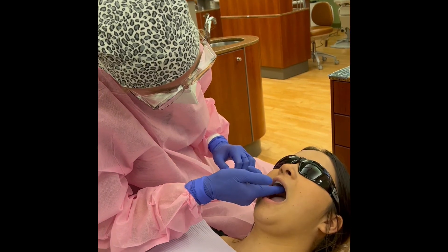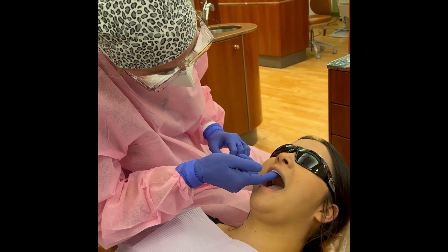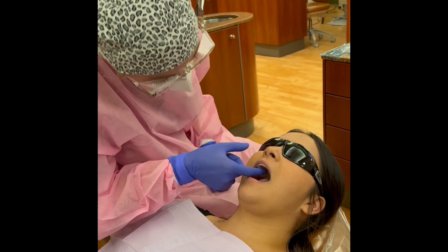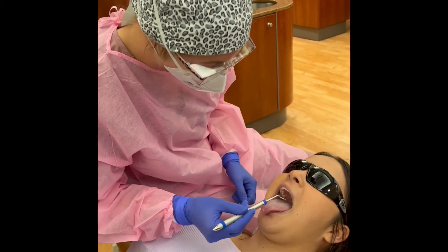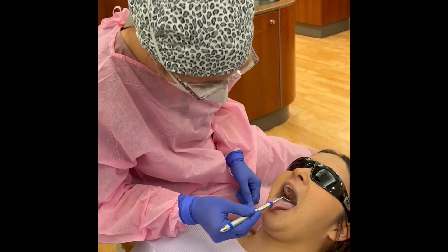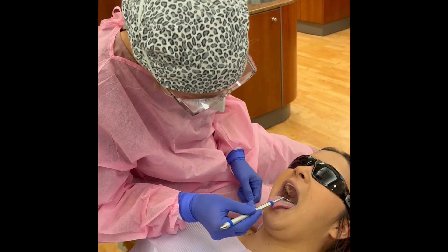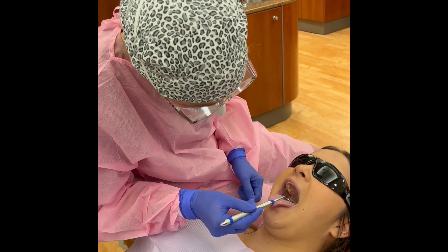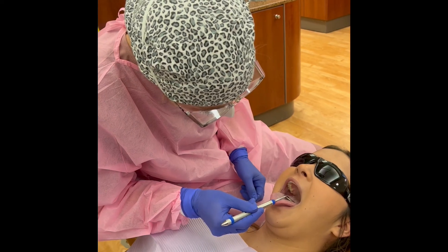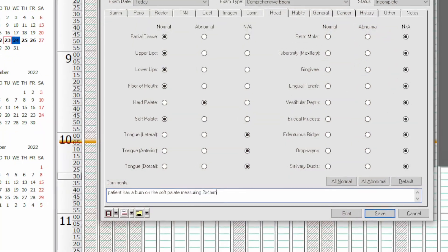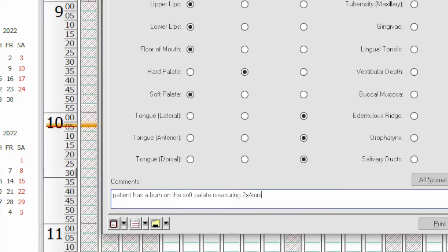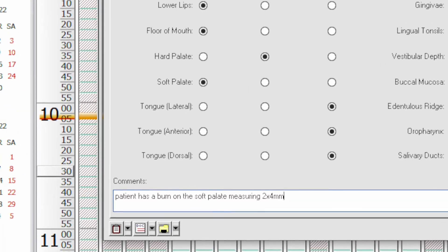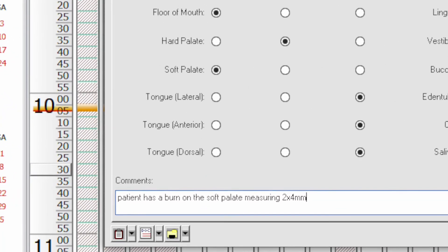Visually inspect and palpate the hard and soft palates. Carefully depress the tongue with a mirror and ask the patient to relax their throat to inspect the tonsillar region and the oropharynx. Document notable findings in the patient's computerized record in Eaglesoft.